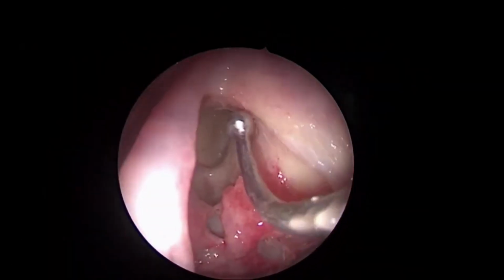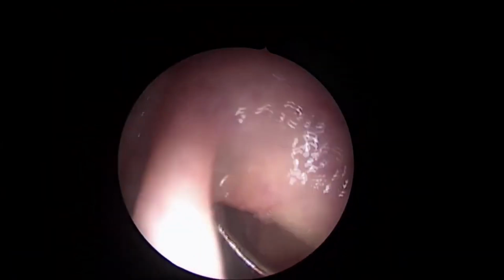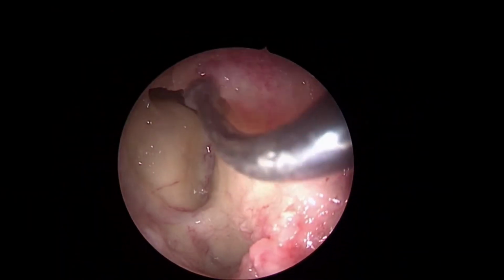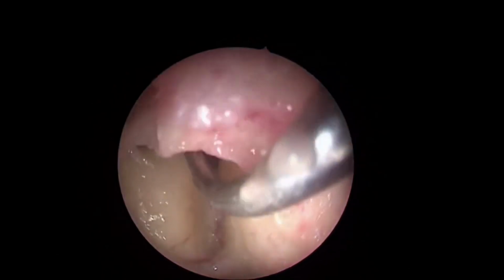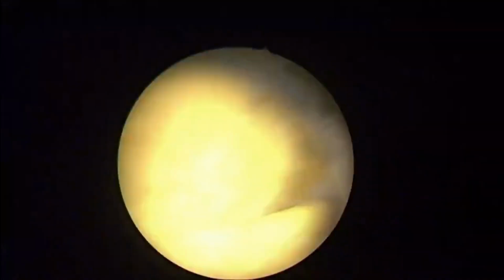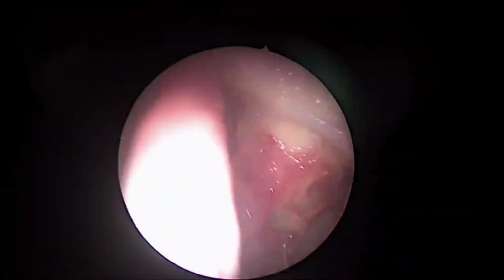So now, what Samir was saying, you follow the beak. You follow the beak, where it ends has to be frontal. Believe me, in any given situation of the frontal sinus you are operating, that patient may have the most difficult anatomy, may have been operated earlier several times, but what Samir has mentioned is exactly this.